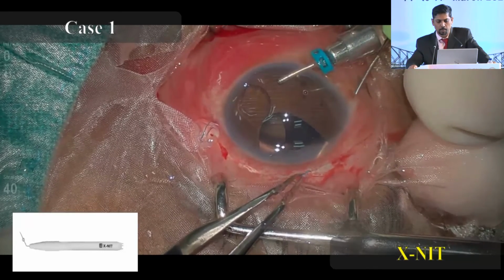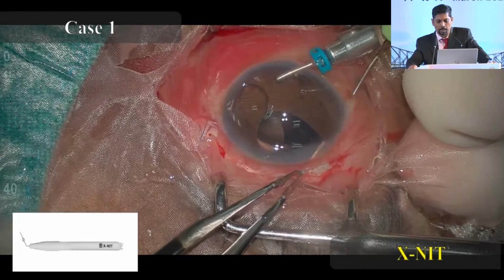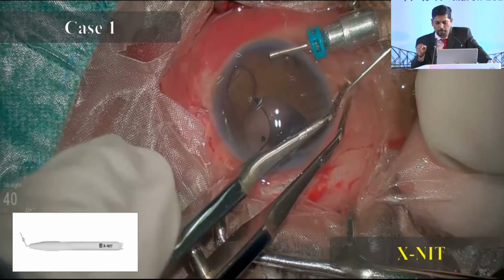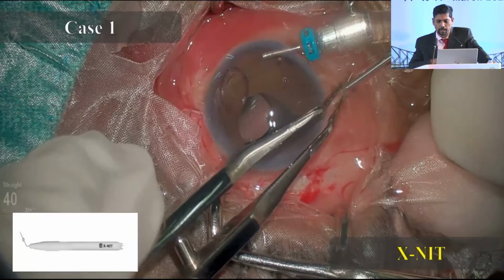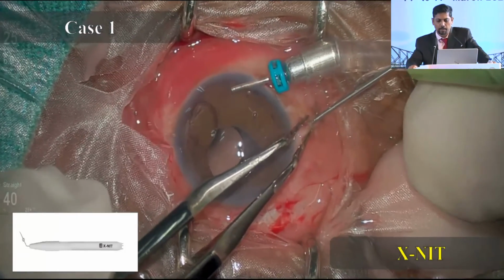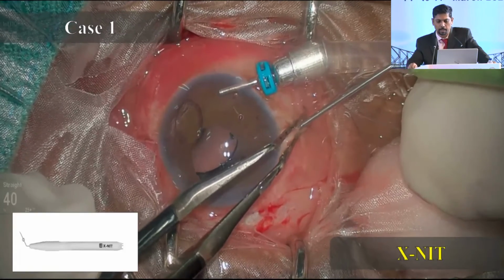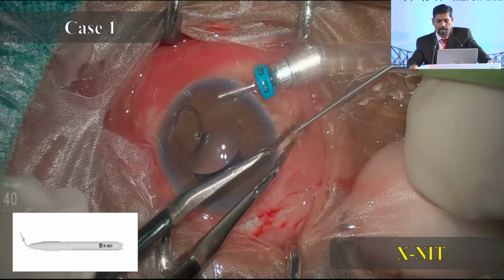Again 2 to 3 mm of docking. Do it. So remember, when you do this step, the tip of the haptic should be facing down and the needle should be receiving it. Then retract the needle. Again, wait for the haptic to be seen. Once you see the blue portion, the haptic, you hold it and gently retract the needle.